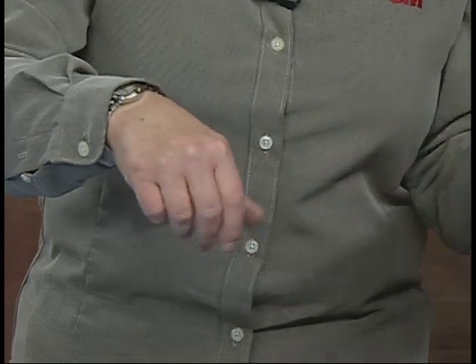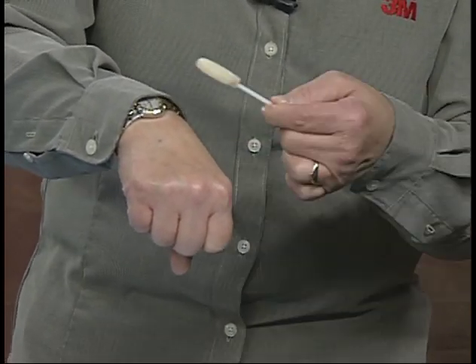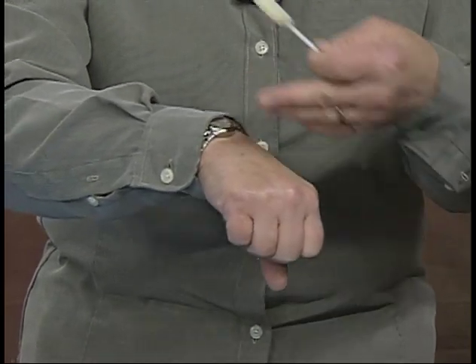The three milliliter wand applicator has quite a bit more fluid in it, and so generally you're going to be using this over larger areas of application. It covers about a 25 by 25 centimeter area, but the principle is the same — just paint it onto the skin in nice, even strokes, allowing that area to dry before moving to the next area.